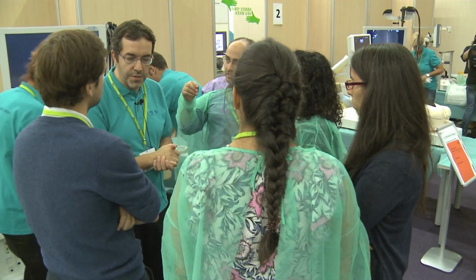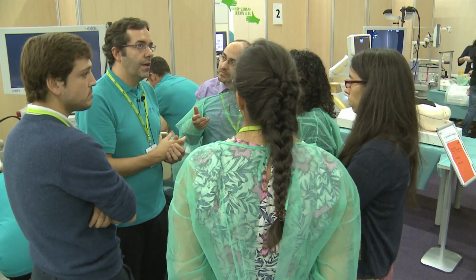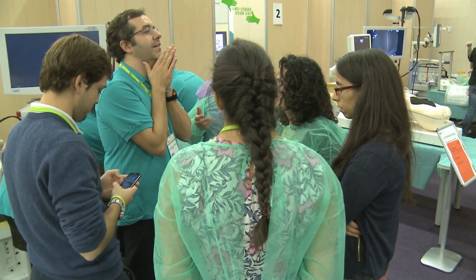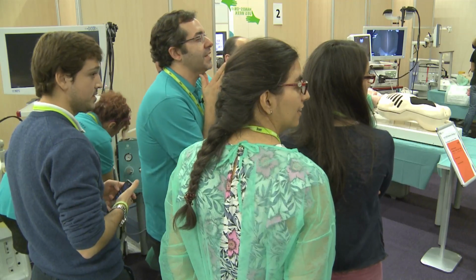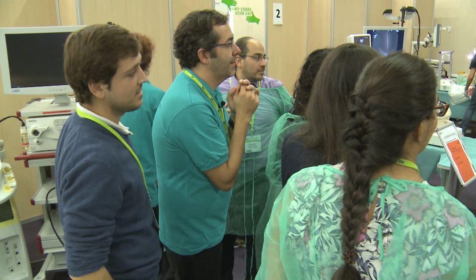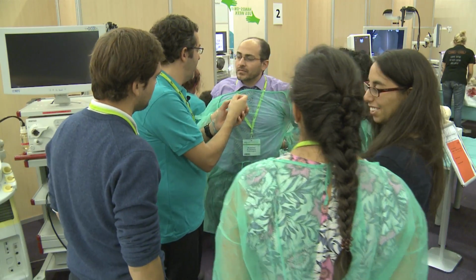I do not know, how do you say tinta china? So it appears from outside? No, that you can see. How do you say tinta china? Jorge, how do you say tinta china in English? Tinta china to mark a lesion. Ink. We placed ink inside of the lesion.